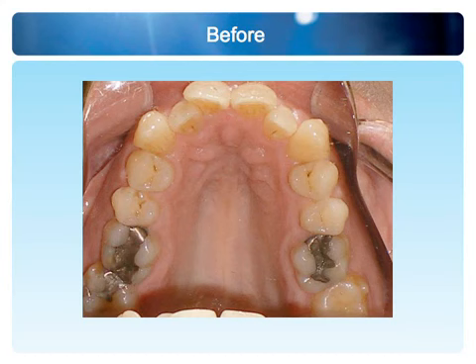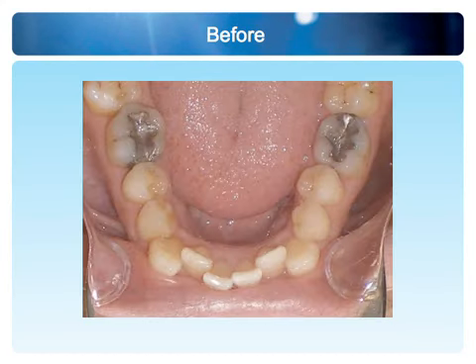without attachment. Well, obviously with an upper arch looking like that, the lower arch is going to have an amount of crowding. And there is a significant amount of crowding here, but never mind the anterior teeth. Back to the posterior teeth. They are leaning in. We can see the entire buccal surface all the way down. We knew from the anterior view that these teeth were angled in, and there is no way the lingual cusps are on the same level as the buccal ones. So we have to keep in mind buccolingual inclination and look to upright this. And the alveolar housing is such that it's in a shape of a nice Roman arch. We love to establish a dome for these teeth.